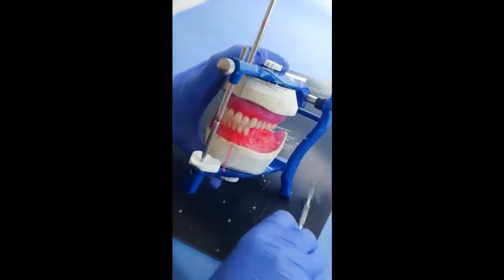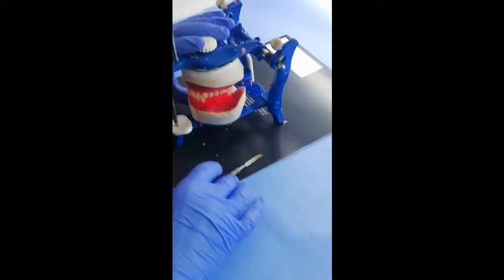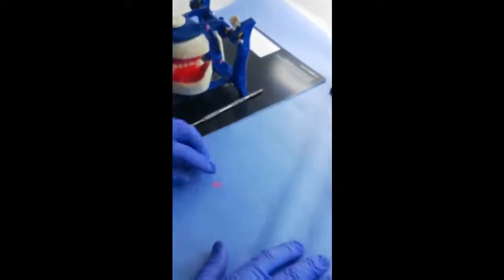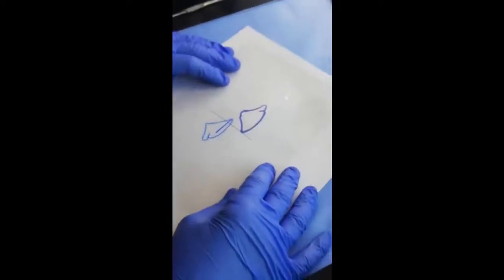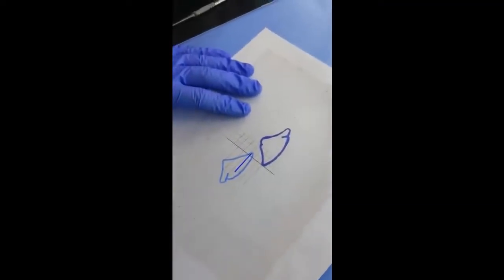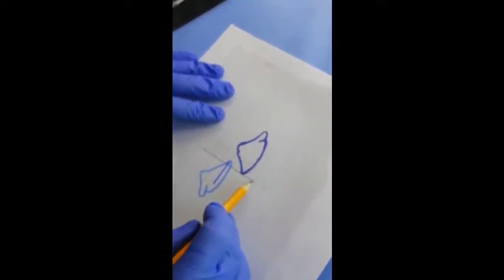Now, as I mentioned earlier, we can control the amount of overjet to overbite, and this will help us to reduce the incisor guidance angle. If you notice here in this diagram, we have the maxillary anterior teeth set to the occlusal plane.